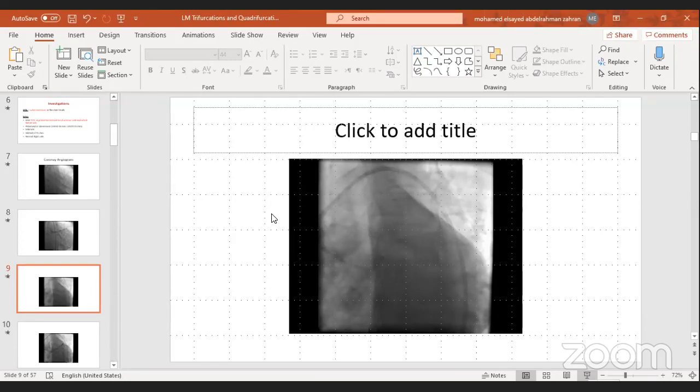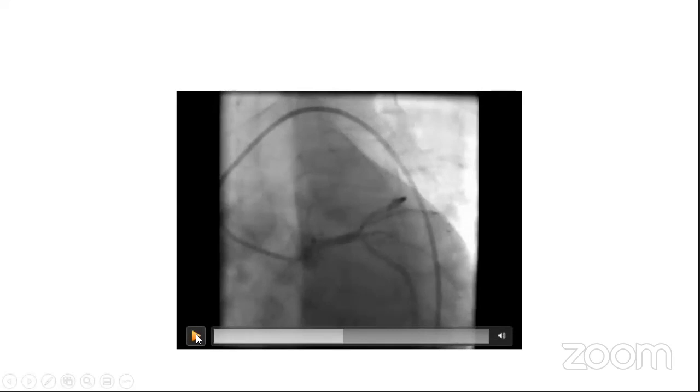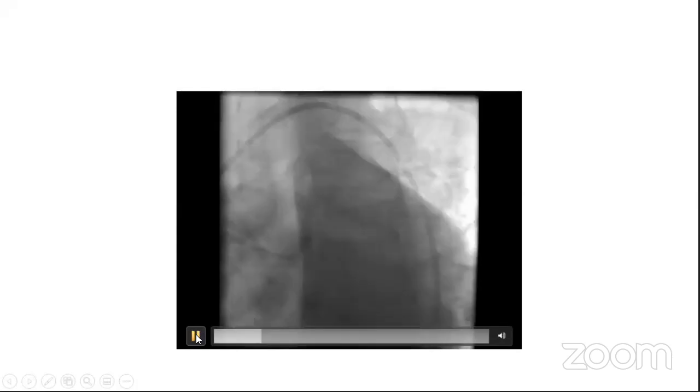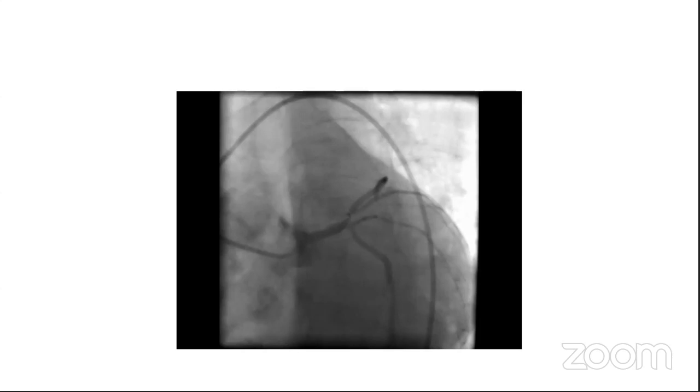I have many patients where I decided to leave that small side branch and then the side branch closes and the patient is having significant chest pain and sometimes significant hemodynamic compromise with this small vessel. My view, I usually wire every single small branch as long as it is included in the bifurcation or the trifurcation. If it is lost, like an ostial pinch, and it's not significant and nothing is happening, I can leave it. But at least I have to put a wire inside so I can access that vessel later.